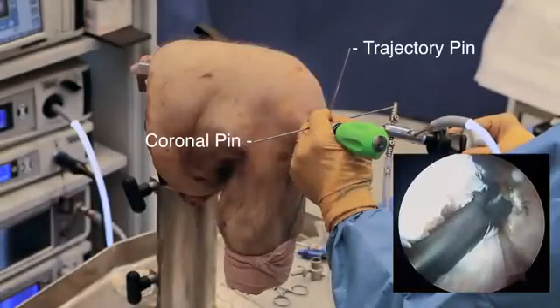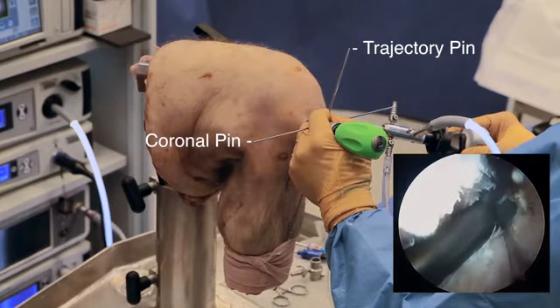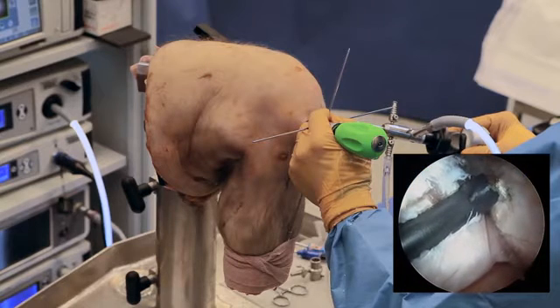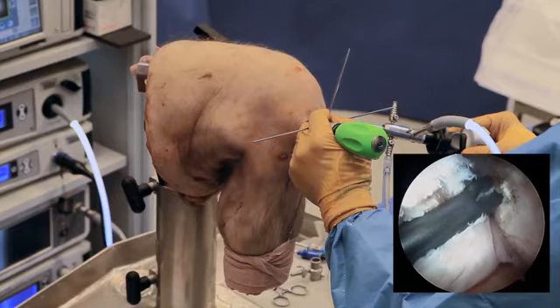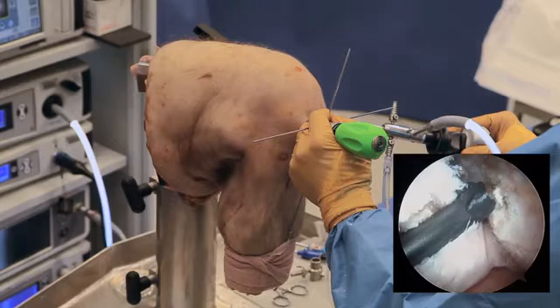I'm in 90 degrees of flexion, and I've got this back wall hooked. If you look at the alignment system, my coronal plane alignment guide is in line with the tibial plateau, and my trajectory guide looks like it's going to exit the anterior lateral aspect of the femoral cortex, which is right where I want it to be.